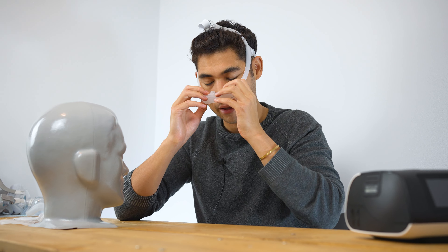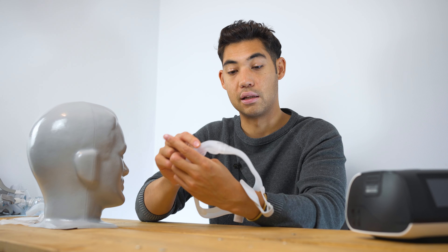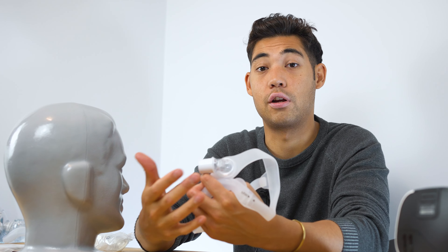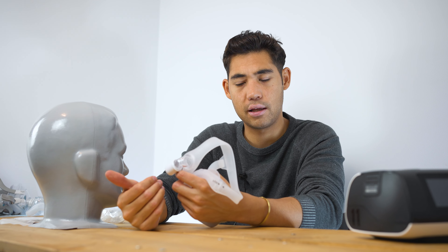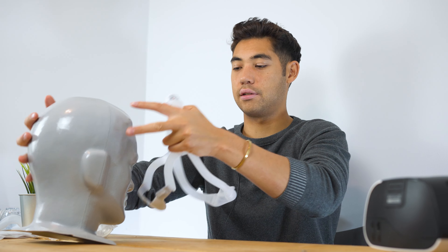Let me take this off and put it on myself. I would normally use the small, but it's kind of hard to see on camera the problem I'm having, so the medium-wide exemplifies the issue — it looks a lot more obvious than it actually is. But when I'm lying on my side and the pillow pushes upward, you can see right there — it doesn't take much. As my nose bends, it leaks right there. That occurs with the medium-wide, that occurs with the small — whatever size I use. It comes with small, medium, large, and medium-wide in the fit pack. No matter which one, that is a problem. I do have leakage right around that area with the nose if I'm sleeping on my side.